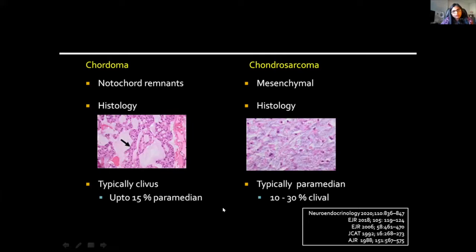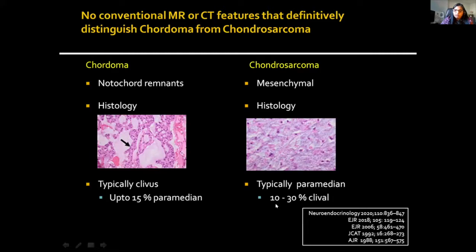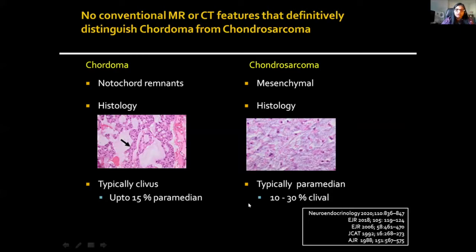Chordoma and chondrosarcoma arise from different embryological elements and are histologically quite distinct. In terms of location, chordomas tend to be typically clival, although up to 15% have been reported as paramedian. Chondrosarcomas typically tend to be paramedian, although almost up to 30% in certain reports show clival location. Importantly, a number of referenced studies have shown that there are no conventional MR or CT features that definitively distinguish a chordoma from a chondrosarcoma.